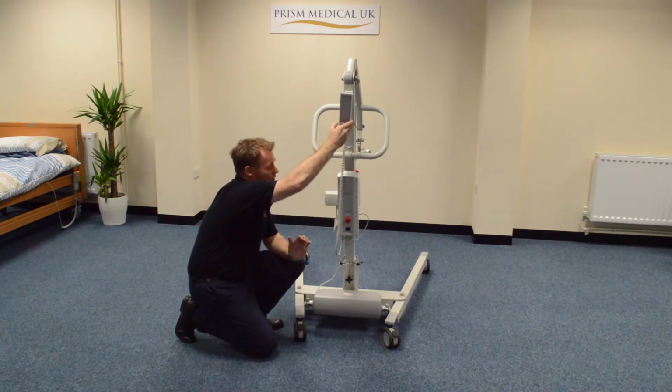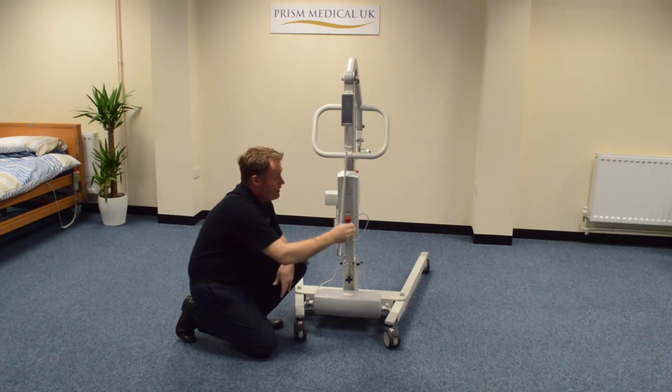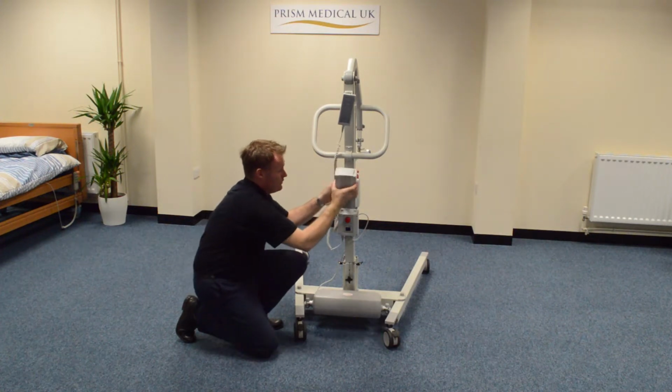To actually charge the hoist, the mains lead plugs directly into the side of the control box. Alternatively, the battery can be removed and taken to a remote charger on a desk in an office just away from the hoist unit itself.